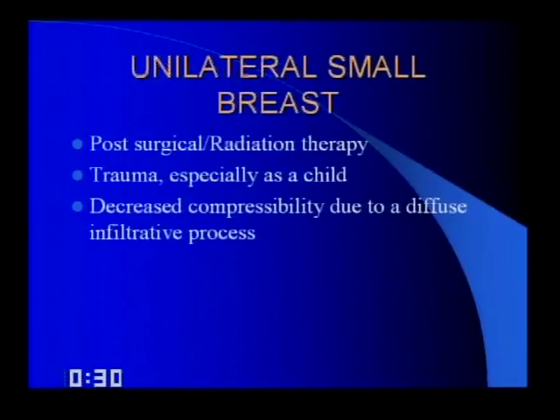And actually, Dr. Newstead said I should add idiopathic. A lot of times, the lady will tell you, well, my right breast has always been smaller than my left, and that's just an idiopathic sign. But this lady obviously had a new finding, not something that was old.